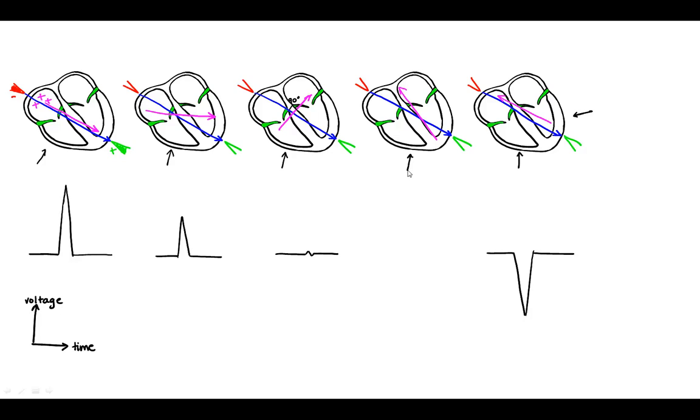And if we were to go to this middle case, pretty similar to this second case right here, except that it's in the negative direction. So we see that our charges are moving in kind of a way that is opposite to the blue vector, but it's not completely aligned. So we're going to see some kind of negative deflection, but not as strong as in the last scenario.